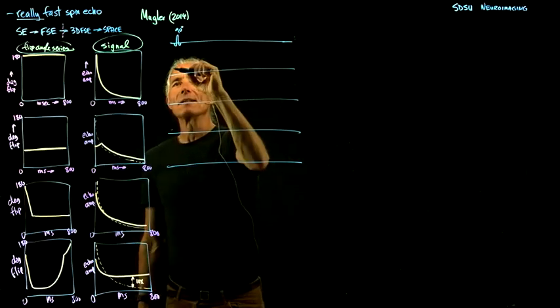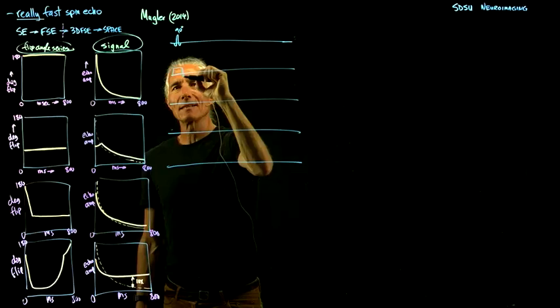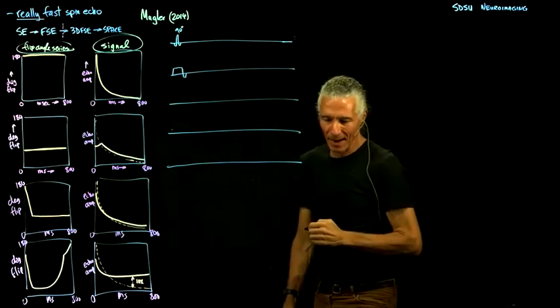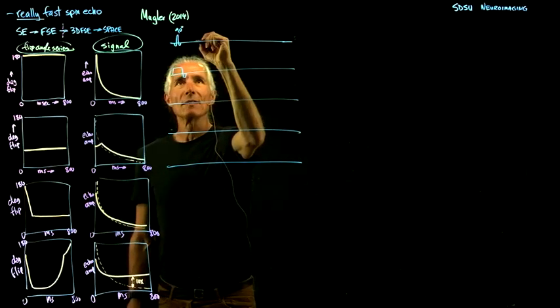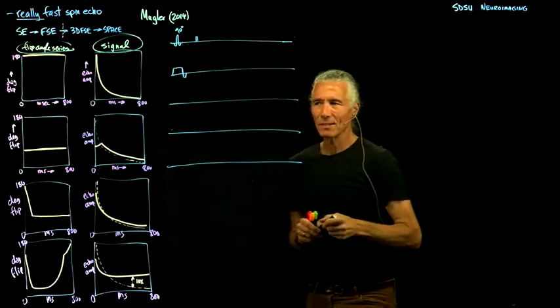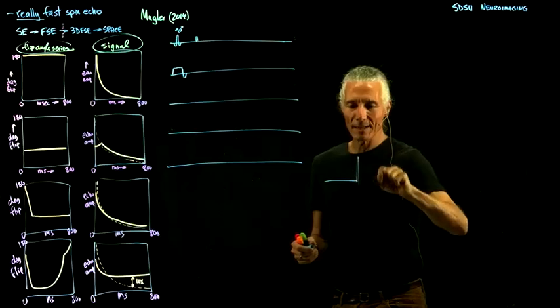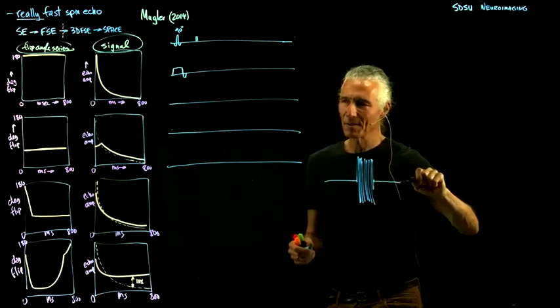and then you're just kind of wasting time. So we'll still do a slab select for the first 90, but then after that, just do a hard pulse. And so what is a hard pulse? You can do that very quickly. That's just like turn the transmitter on and it just goes ding. It just wiggles a bunch of times and you just turn it off.